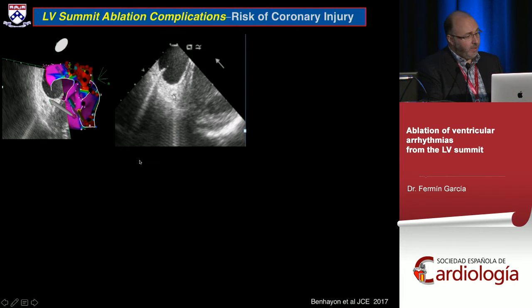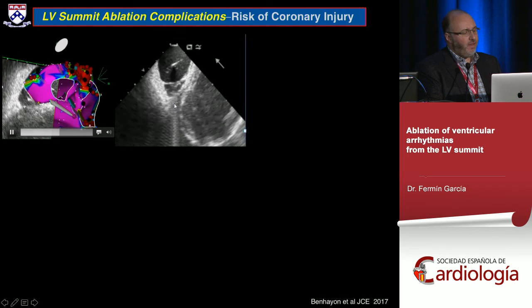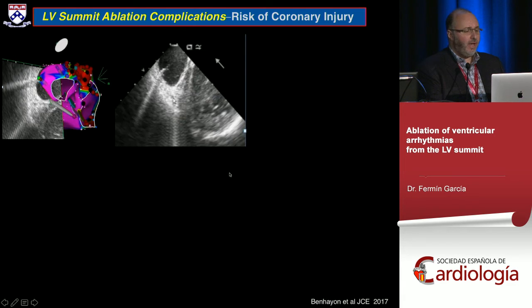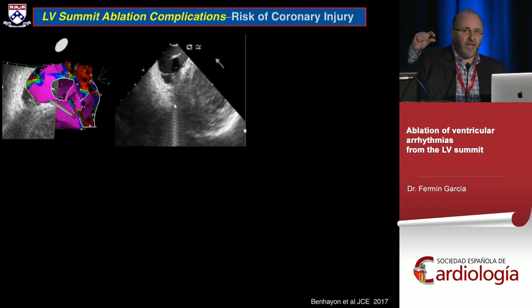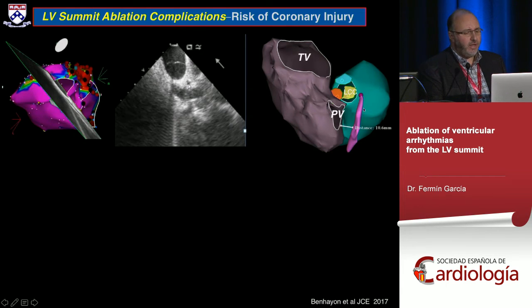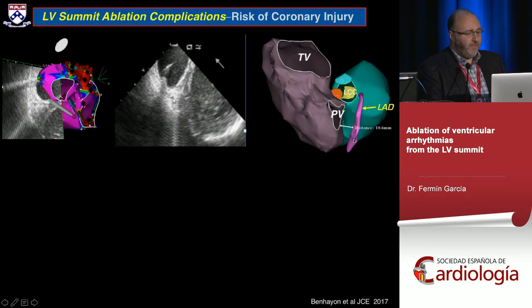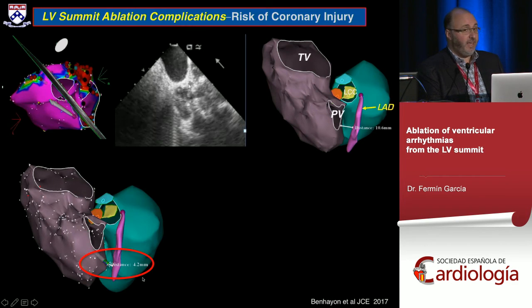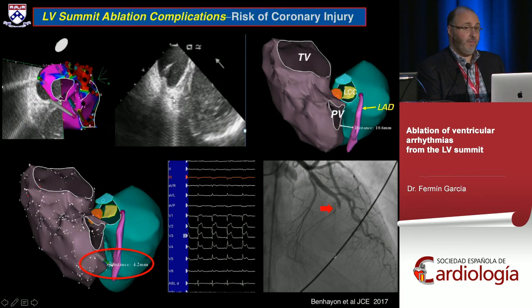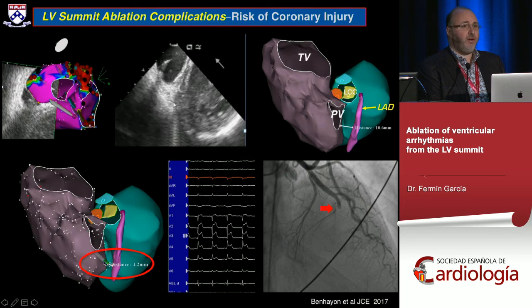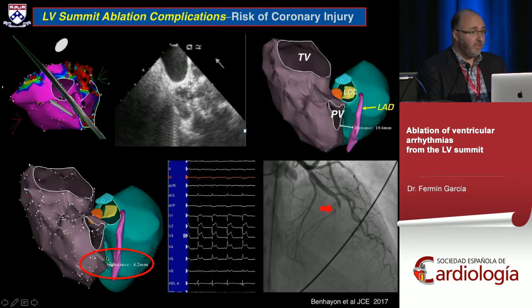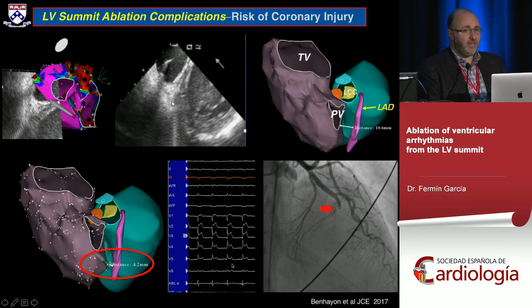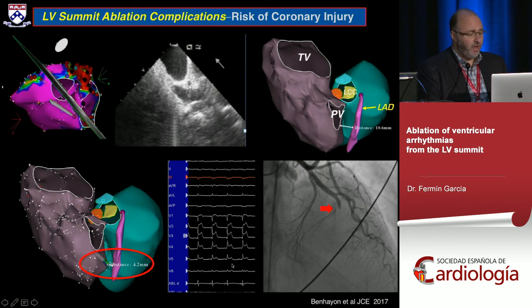Using ICE, you can follow the LAD from the left main all the way down and measure the exact distance from the endocardium to the LAD. We reconstruct the LAD with CartoSound — if the distance is greater than five millimeters, you're probably okay. If less than five millimeters, serious risk exists. A patient who received high-power ablation in the anterior RVOT for an LV summit PVC with a -15 ms electrogram developed LAD thrombosis at the mid level with ST elevation — this is the danger.